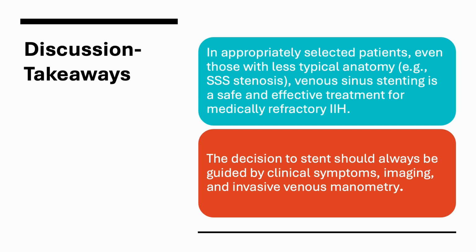Finally, while the procedure is promising, it demands careful patient selection, meticulous technique, and diligent follow-up to manage potential complications. This tailored anatomy-specific approach is indicative of the evolving role of interventional radiology in neurovascular disorders.